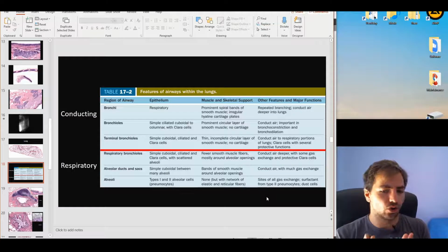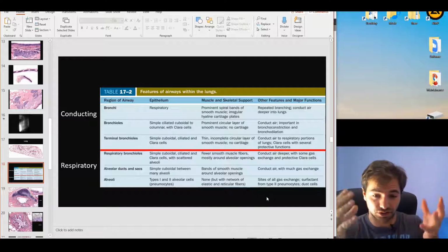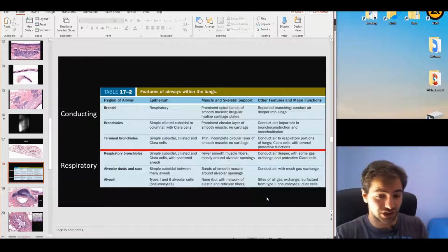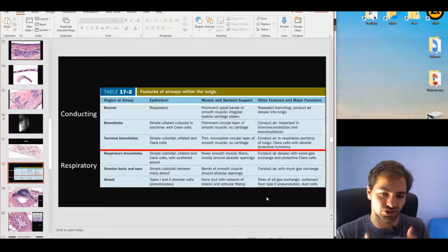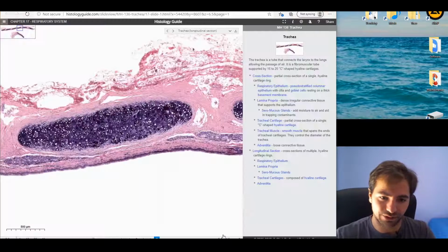So the whole gas exchange procedure should be discussed in the end in order to really understand first the histological section, the histological technique, the histological rationale and morphology, and then we're going to move on later to the function, to really go through this unique and wonderful gas exchange and the whole structure of this logic. So let's start seeing these things in the microscope.